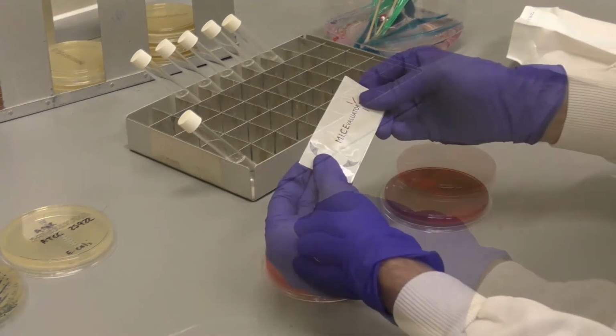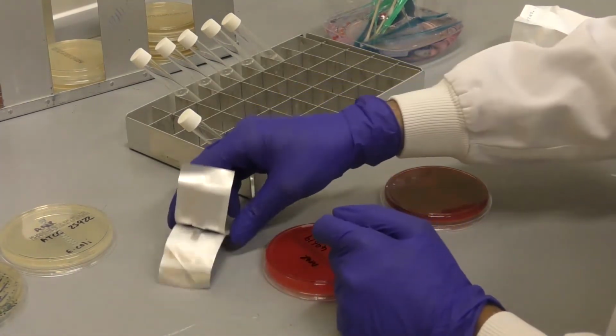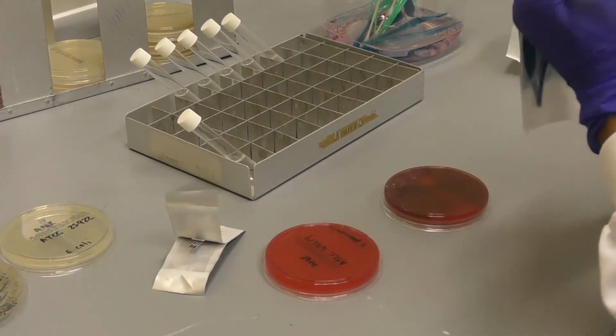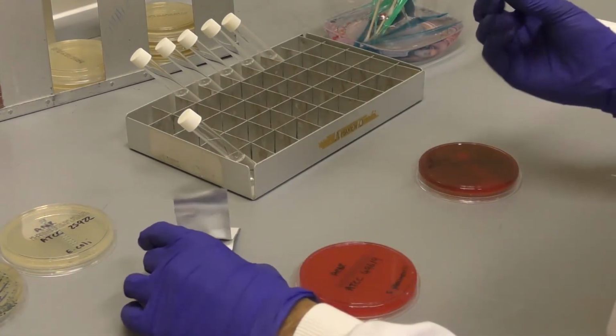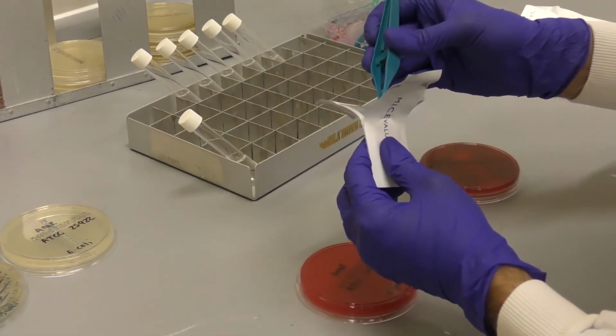Strips can be applied to the agar surface with single-use forceps or flamed metal forceps. Position the gradient with the MIC scale facing upwards towards the opening of the plate and the concentration maximum nearest the rim of the plate. Ensure that the whole strip is in complete contact with the agar surface.